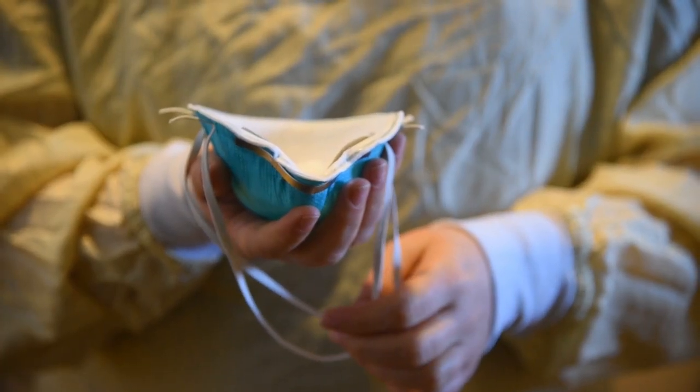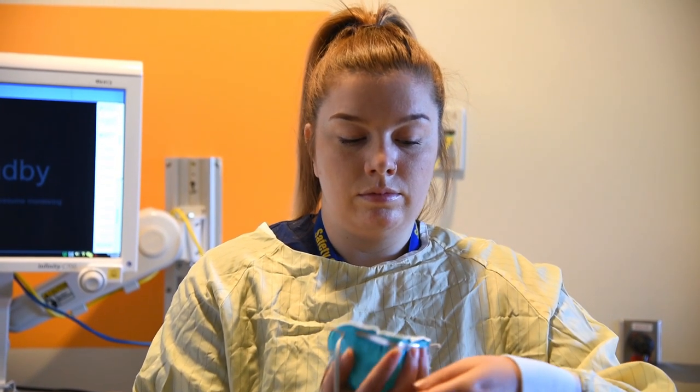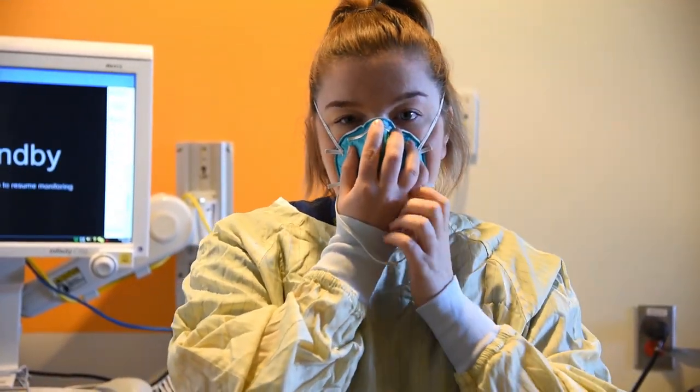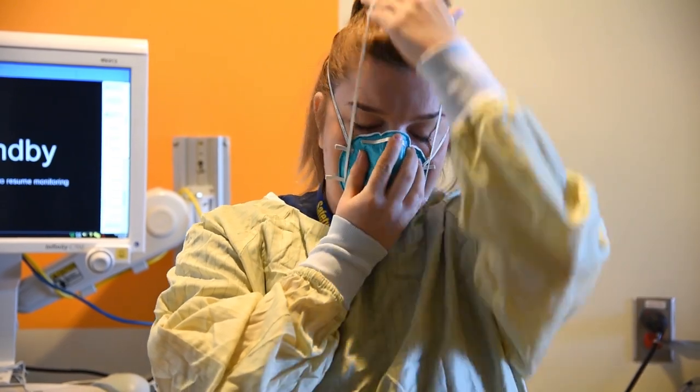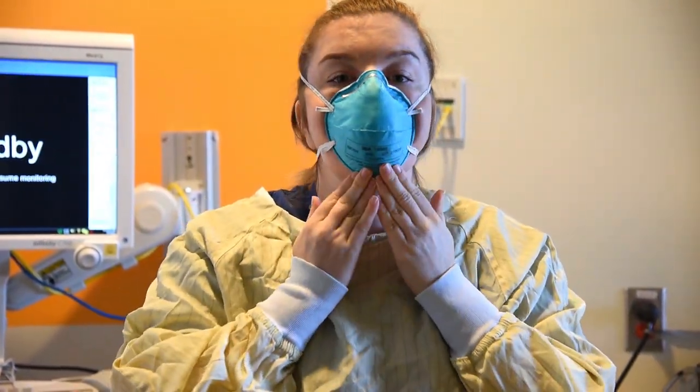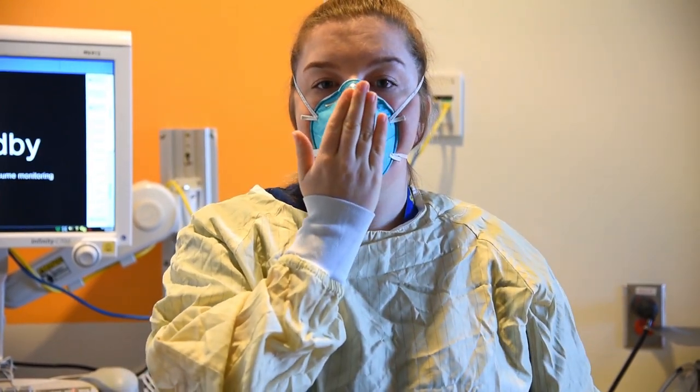Cup the N95 respirator in your hand and position it under your chin with the nose piece up. Secure the elastic band around your head — top strap first, followed by the bottom strap. Use both hands to mold the metal band of the N95 respirator around your face and perform a seal test.